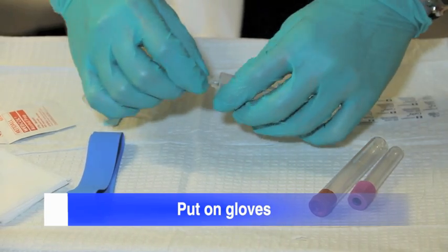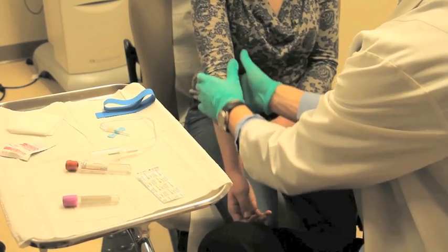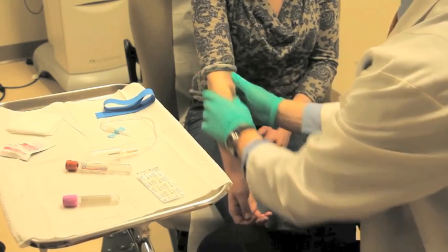Put on gloves and begin by assembling the vacutainer adapter and needle apparatus. Politely roll up any clothing covering the venipuncture site and tie the tourniquet to the patient's arm. Since a loose tourniquet is perhaps the most common cause of venipuncture failure, we offer nine steps to tourniquet placement.